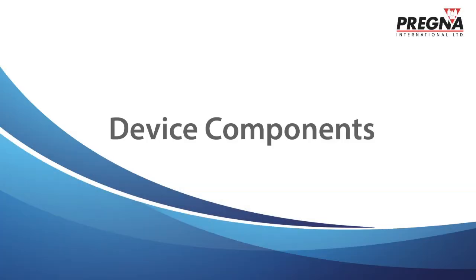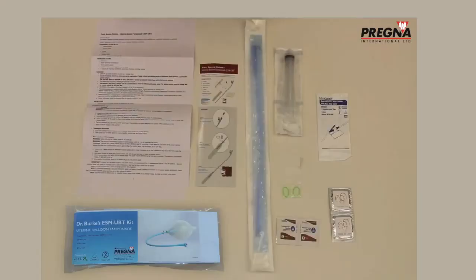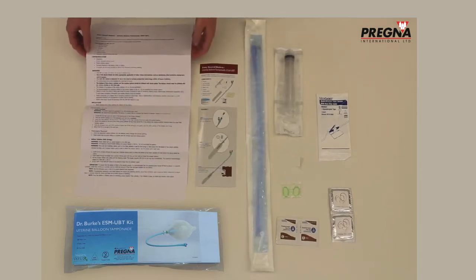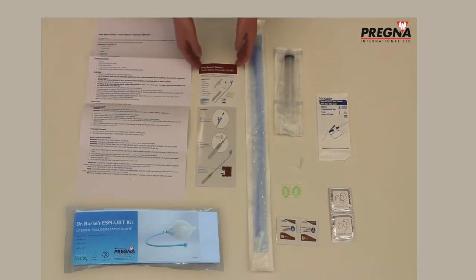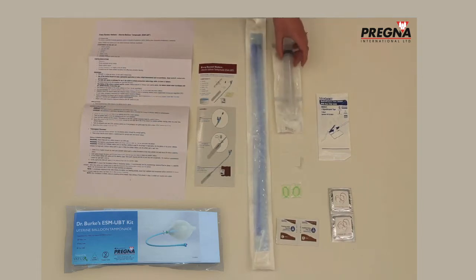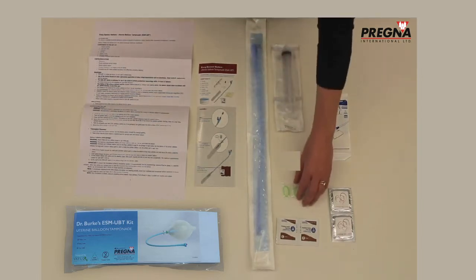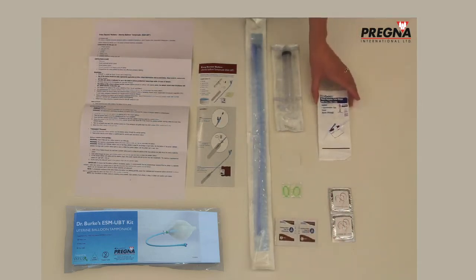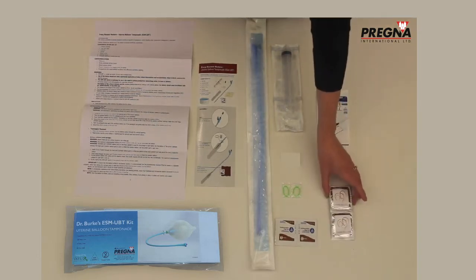Dr. Burke's ESM-UBT Kit includes 8 components: an Instruction Manual, an Instruction Card, a 24 French Silicon Foley Catheter with Luer Lock, a 50cc Syringe, 2 O-rings, 2 Iodine Prep Pads, a Catheter Holder with Hypoallergenic Tape, and 2 Latex Condoms.